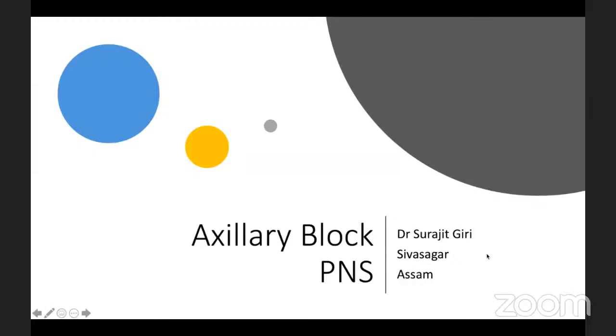58 patients had fractures, and the rest elbow surgery with various procedures, and this was around supracondylar procedures. We found that out of 100 patients, in 69 we got the response at first attempt, and needle manipulation was required in 31 patients. Vessel puncture was there in 13 patients, but it was very much compressible. It is superficial, no issues at all, and complications were totally 0.